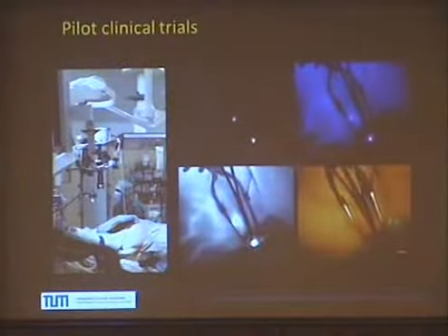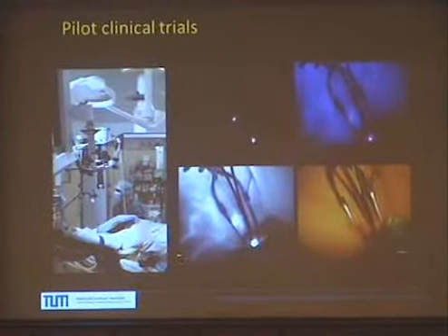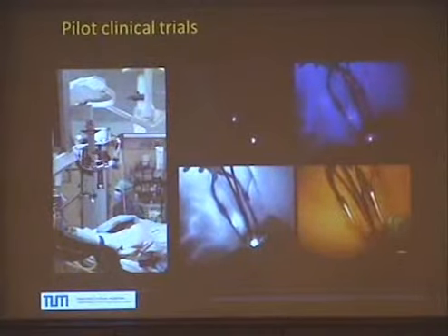And of course, we can use these cyanine dyes to identify the lymphatic system as well. And this is just a sentinel lymph node. This is the site of injection directly into the tumor. This is breast cancer now. And we can see the sentinel lymph node, the lymphatic system. And our hope is that we can use dyes to also see cancer in the lymph node so that we know before even resecting the lymph node if it is positive or negative.